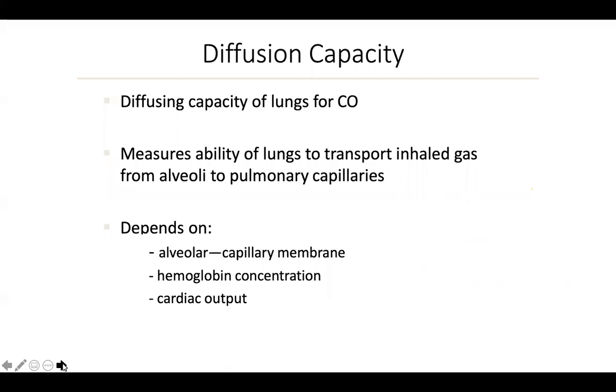Another method of measuring is the diffusion capacity of the lungs for carbon monoxide. Why do we use carbon monoxide and not any other gas? Because the transfer of carbon monoxide is limited solely by diffusion.